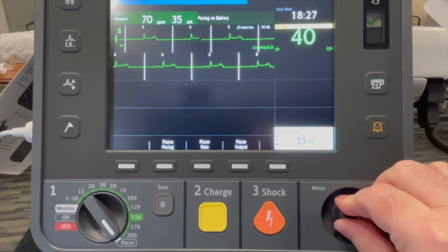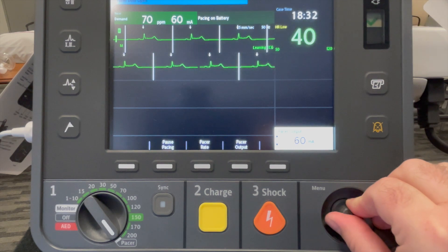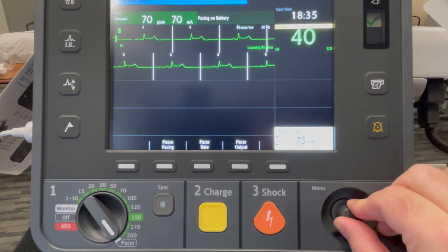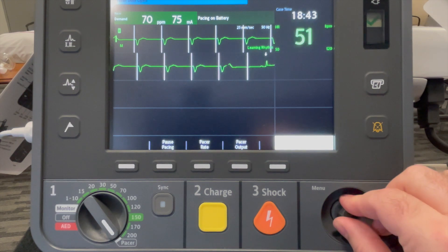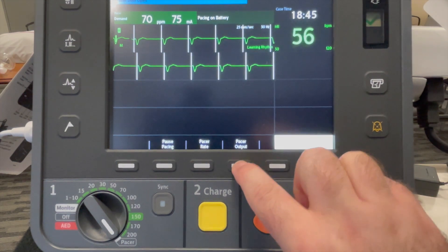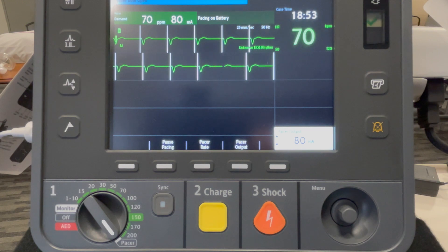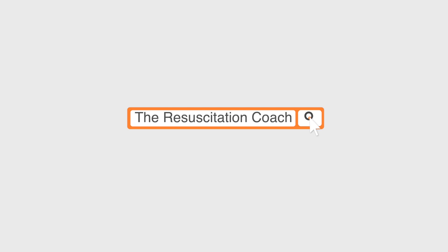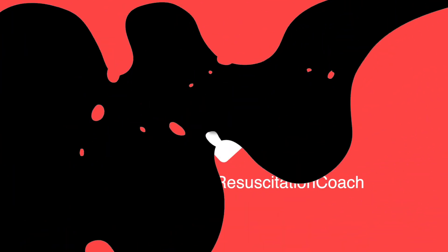Here we can see the pacing spikes on the screen. Here we have a pacing spike immediately followed by a wide QRS — so we've achieved capture. I want to go slightly higher to 80 milliamps to create a buffer. Check your patient's pulse and repeat vital signs.